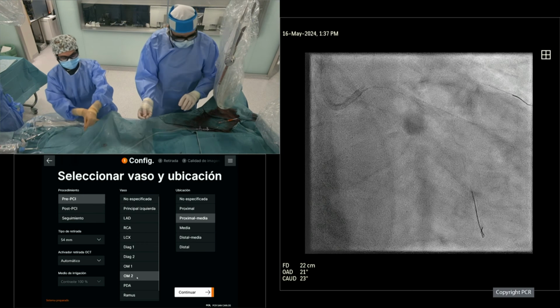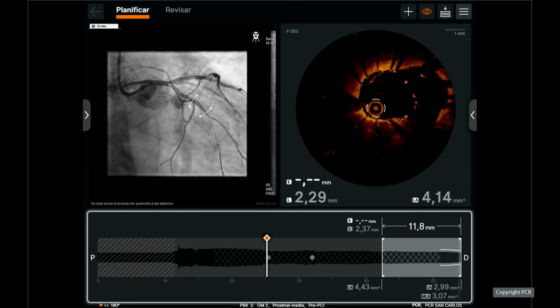Let's go to the more critical area, which is the one of interest. Yeah. And here you can see what happens often in these situations is that the lumen is so irregular in shape that you get areas where it's impossible for the stent to be completely apposed, because the lumen is absolutely irregular. For sure, I think we have some room for some post-dilation in this. Okay. If you can go a little bit quickly back to the left main, Nieves, because we're almost running out of time. Yeah, exactly. So this is the left main, and here again, it looks like we really need to post-dilate more with a 3.5 balloon, all the proximal circumflex into the left main.